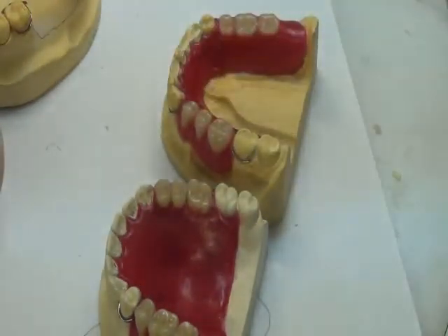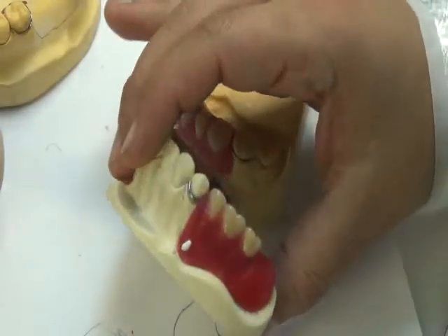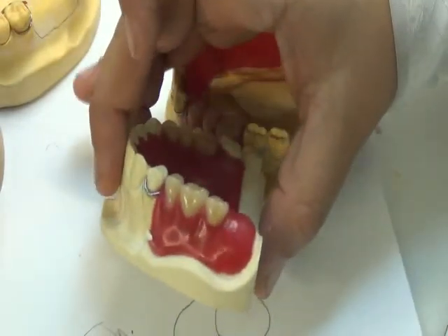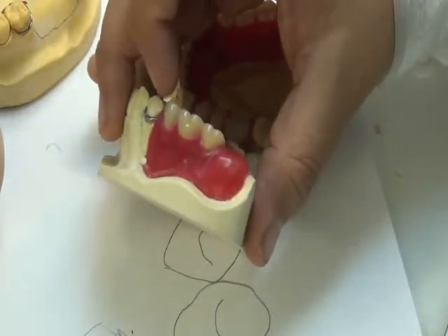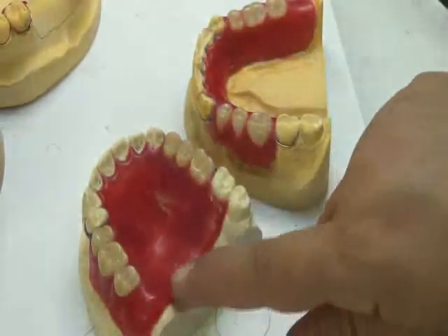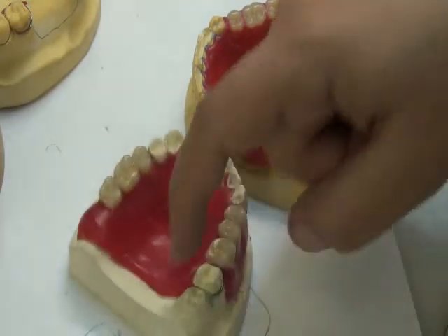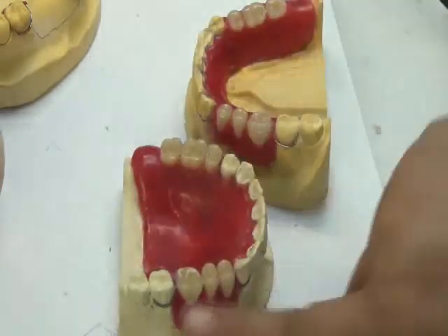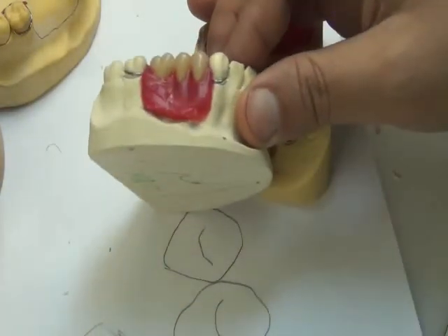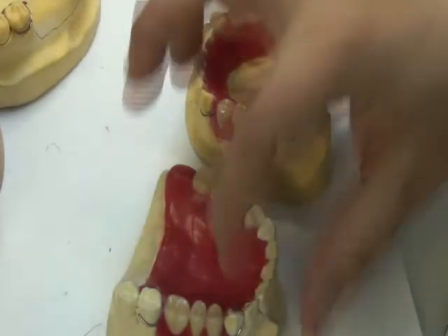Once we finish setting the teeth and adding the wax, we will get this situation. On the free end saddle, I come down vertically and follow the full extent of the denture. Palatally, I don't go beyond the vibrating line. The abutment, I reciprocate it. I go down, but I don't need to reach the full extension of the sulcus. I could end even shorter than this. I go back and embrace the abutment.